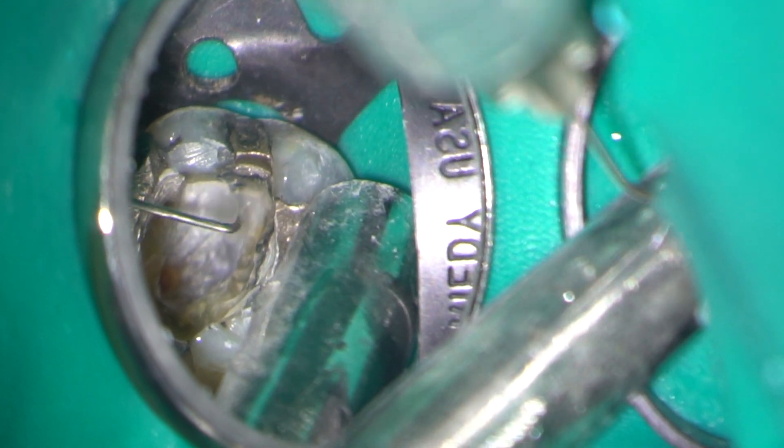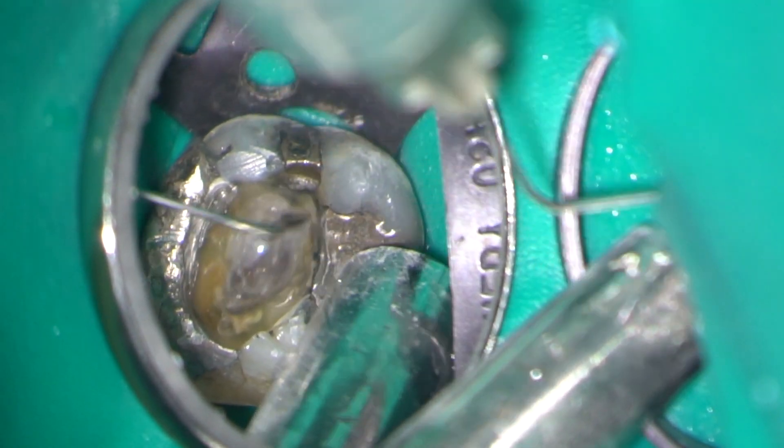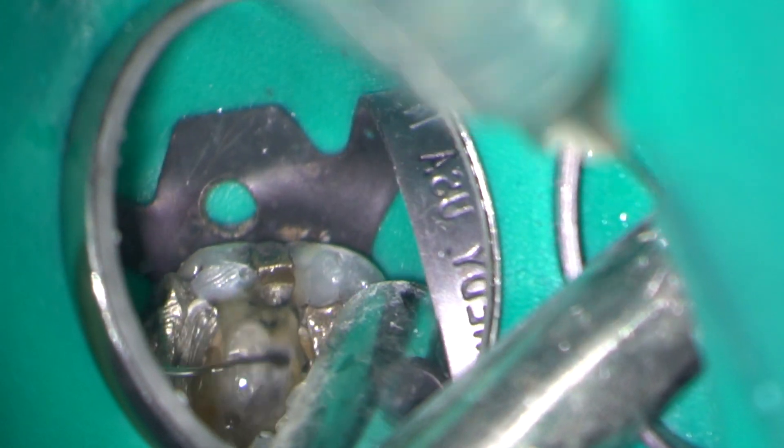Under the microscope, you can see that I have removed the temporary restoration and I'm now just flushing out the access cavity with 3% sodium hypochlorite.